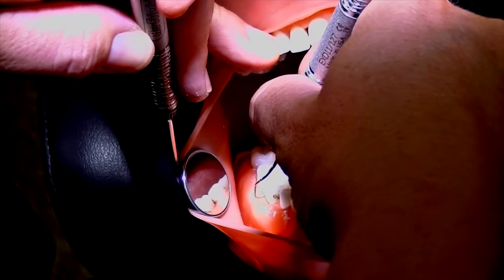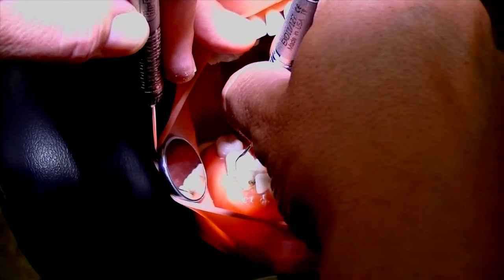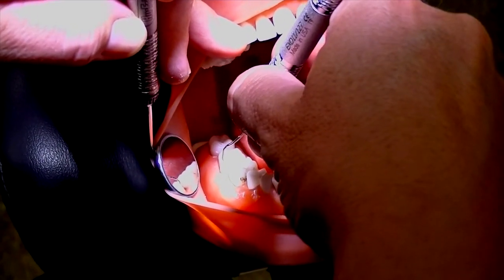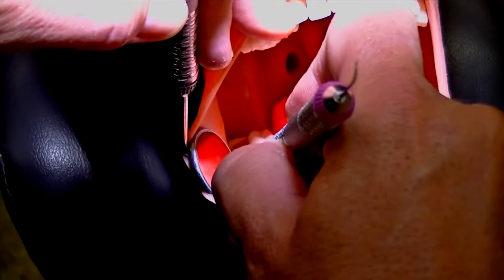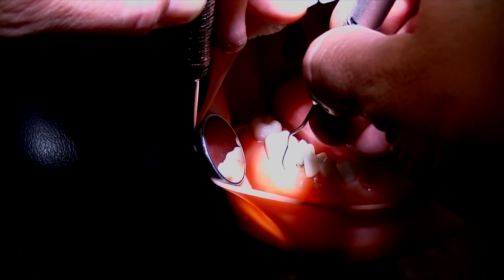Okay, so inserting at the distal line angle, vertical motion activation with the wrist, up and down to the contact, and then around the contact and out. Turn the tip, reinsert at the distal line angle using the other side now. Oblique strokes. And rotate and pivot, turn and go in between to the contact, midline, and then all the way to the contact and then around.